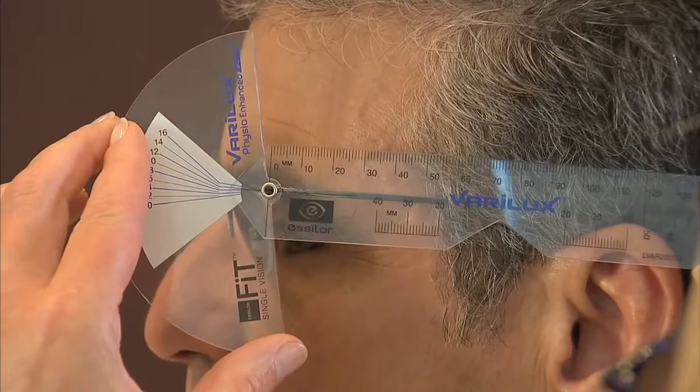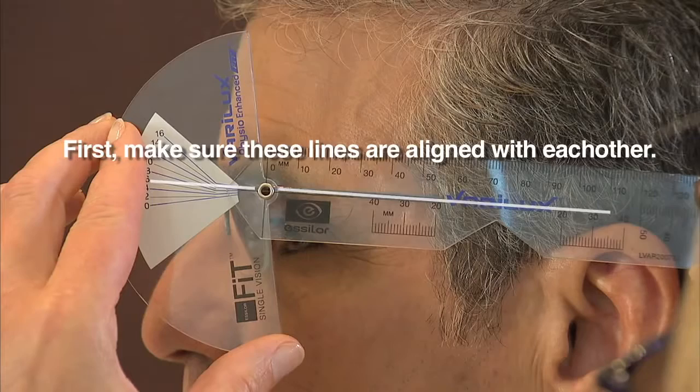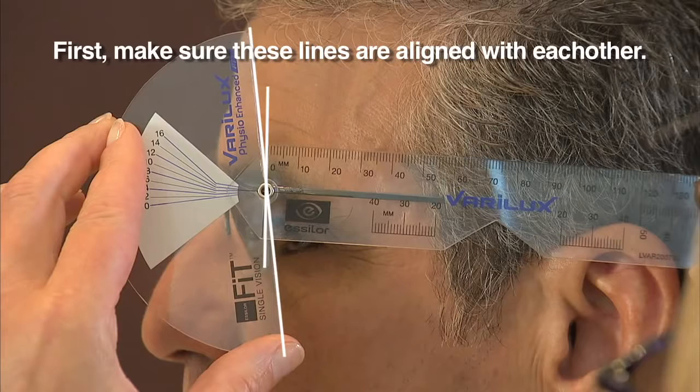The first measurement is pantoscopic tilt, the angle of the frame on the face. Begin by aligning the horizontal line over the Essilor logo with the zero degree blue line on the semicircle. The edge of the semicircle should also align with the vertical line that runs up the ruler to the zero millimeter mark. You are now ready to take the patient's pantoscopic tilt measurement.